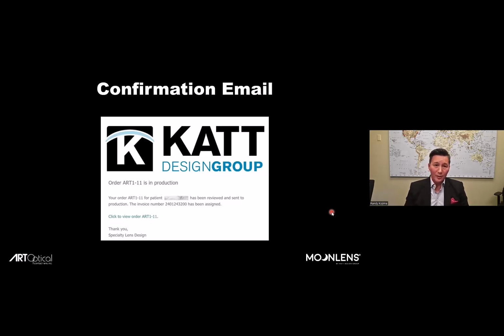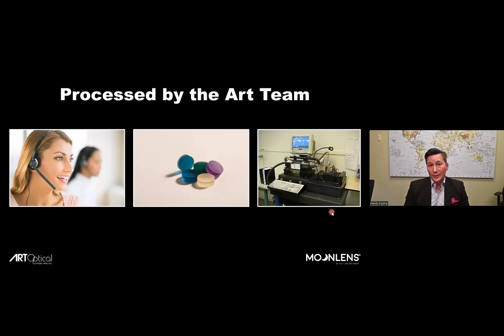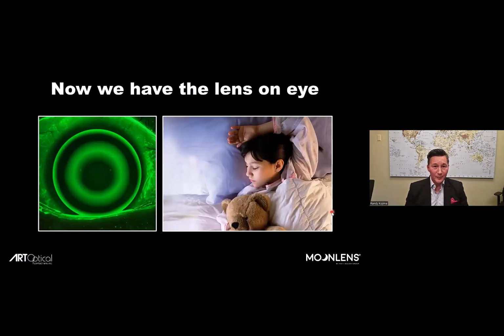So everything is all done, automated in the cloud on the KATTCloud platform. Now, the next step, of course, will be Art Optical is going to take that right or left or OU order, process it and send it to you. And then that's when we really begin the treatment. And this is the point where ultimately we could evaluate the fluorescein.